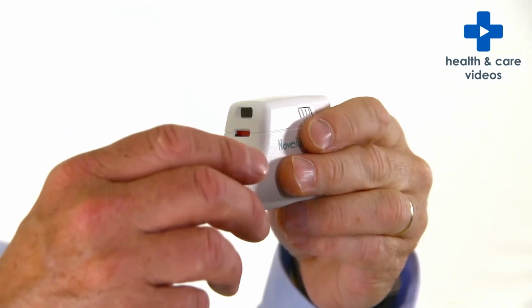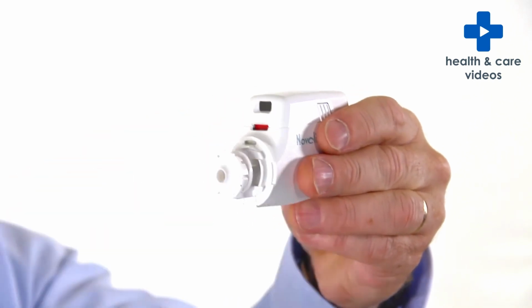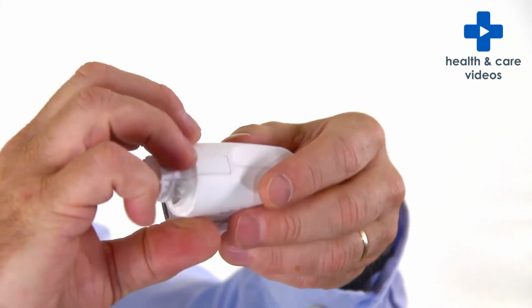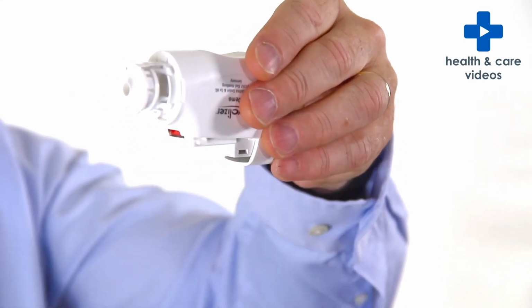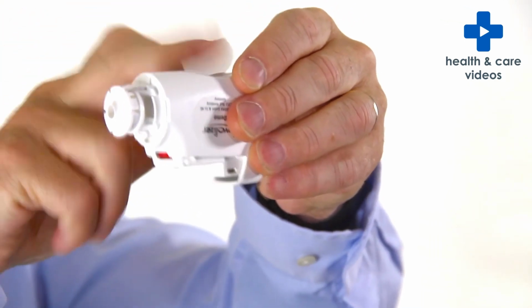Remove the protective cap and twist the mouthpiece anti-clockwise to remove. Turn the inhaler upside down. Loosen the dispensing slide. Tap the inhaler lightly to remove any remaining powder.